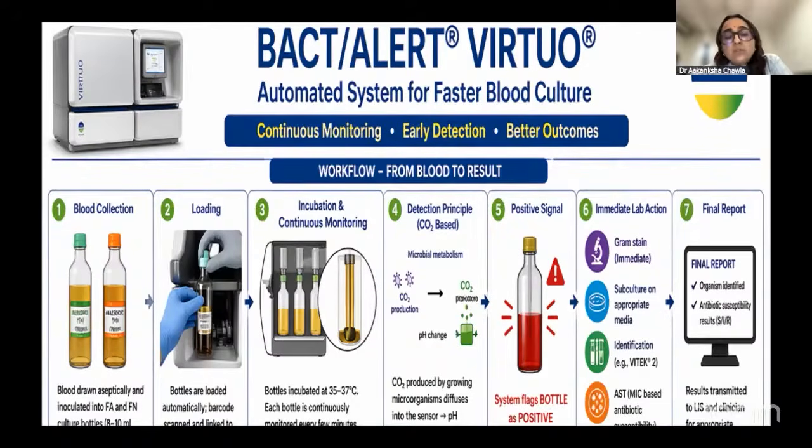And once, the most important, always teach your nursing staff and your paramedical staff who are taking care of the patients to always collect these cultures with full aseptic precautions. Once you've collected and sent these blood culture bottles to the lab, after receiving them.